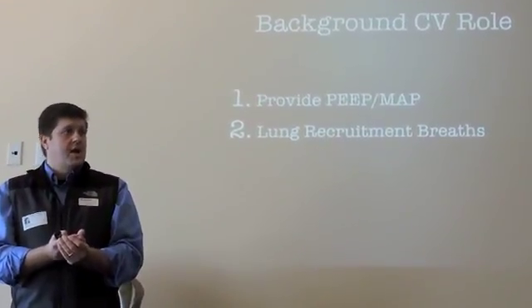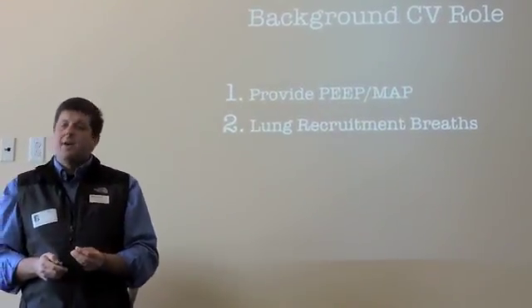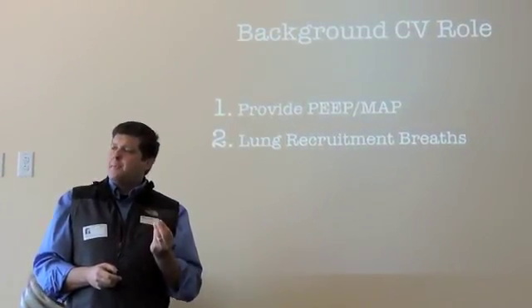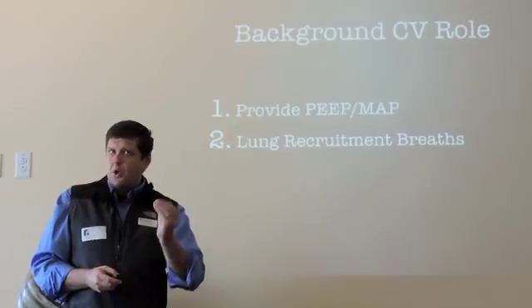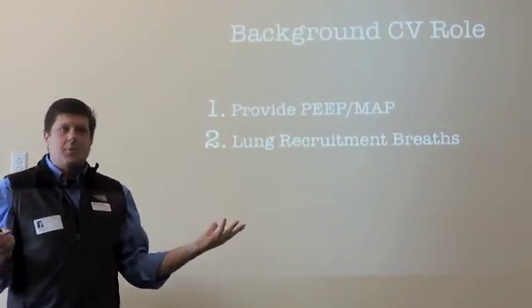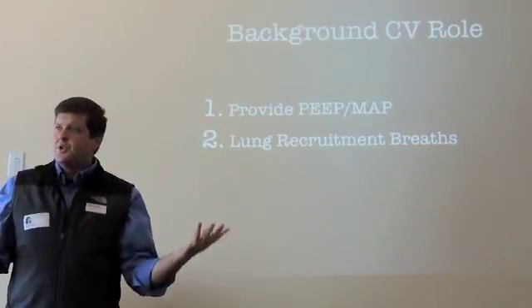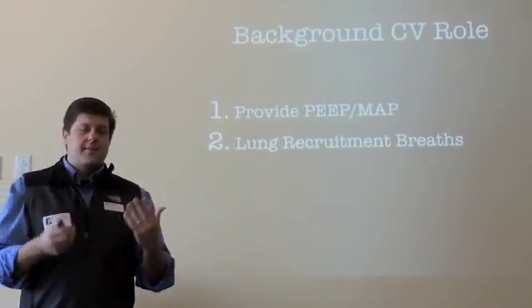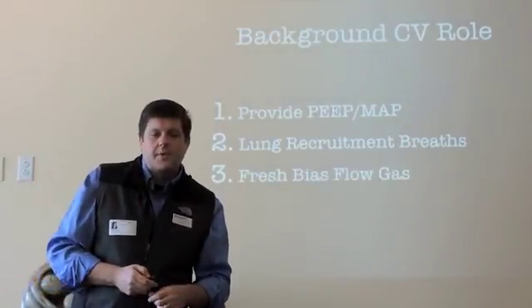care of this kid. Because when we have lung volume loss and atelectasis, in order to recruit the lung back, we have to push in enough volume to get past the critical opening pressure to pop the alveoli open. Well, that's something high frequency will never do. It's too small, it's too weak, it's too gentle. So that's where we use our sigh breaths from the conventional ventilator to help recruit the lung.